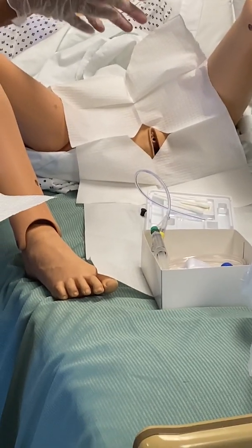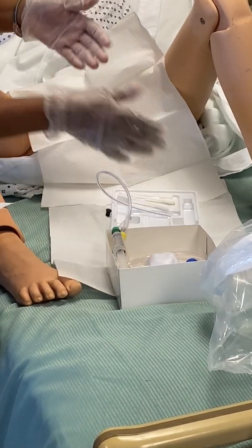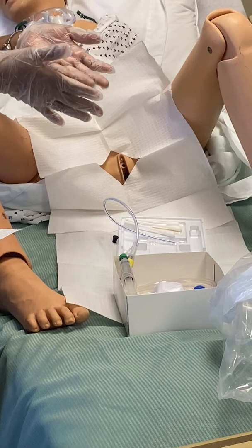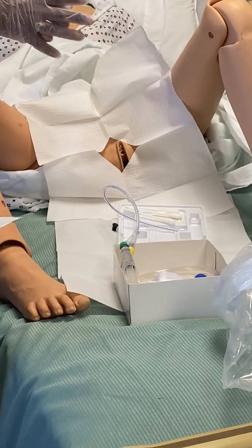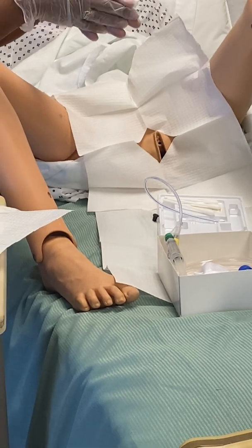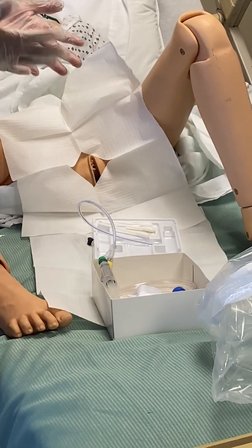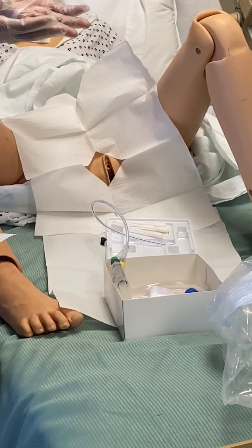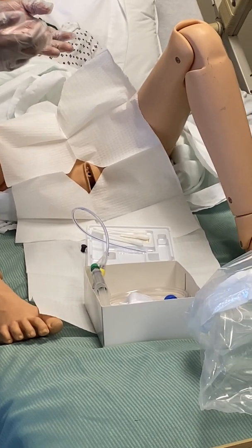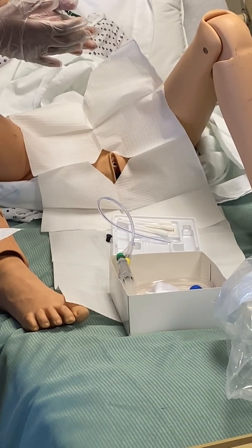What some students choose to do is go on and take this bag out. It does not matter to me, but once I've taken that top off of there and that KY is on it, or lubricant, I just try not to fool with it. It's completely up to you. Some students, like when I pulled it back, they go on and take it out of the box. Whatever works for you. When you practice, you're going to know what works for you. That tells us if you practiced or not.